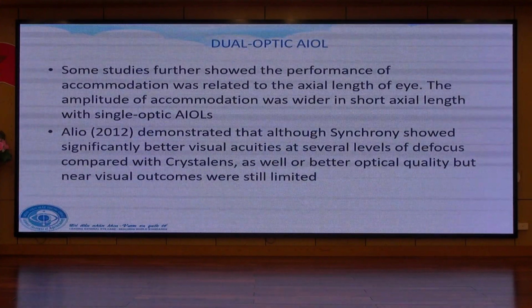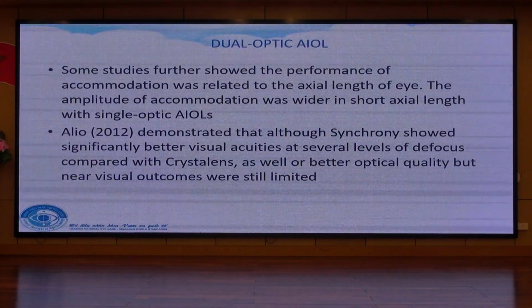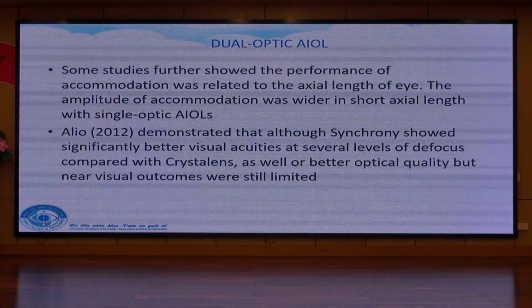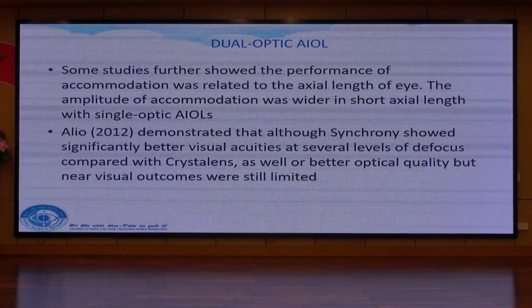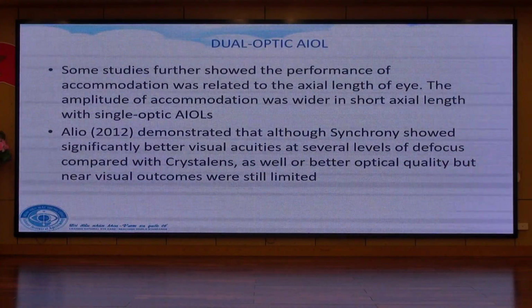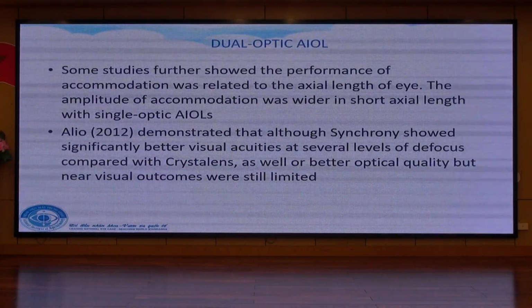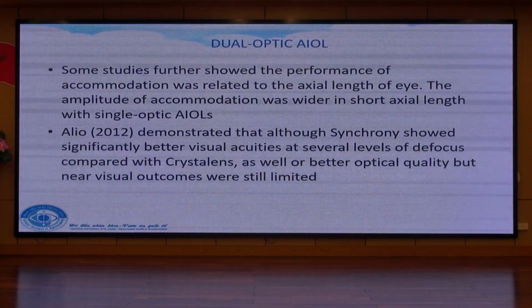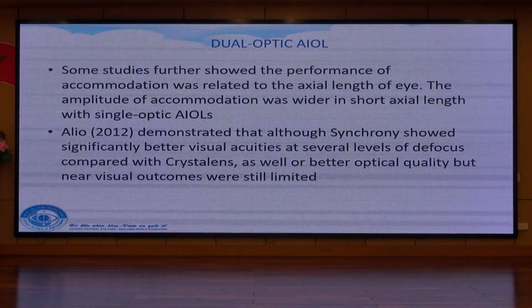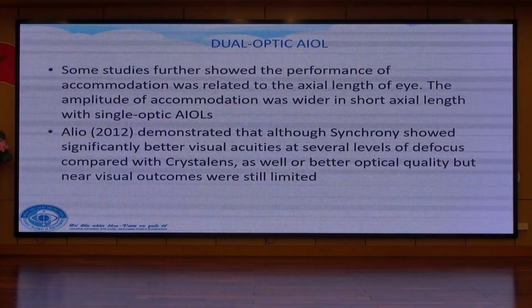And some studies show the performance of accommodation was related to the axial length of the eye, and the amplitude of accommodation was wider in short axial length, less than 23 millimeter, with single optic AIOLs. Another study demonstrated that Synchrony shows significantly better visual acuity at several levels of defocus compared with CRYSTALENS, and as well or better optical quality, but the near visual outcome was still limited.